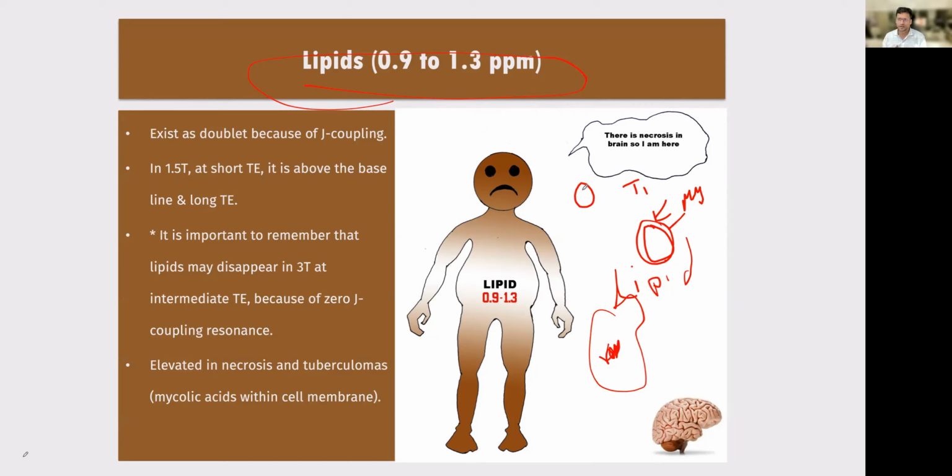I've been lucky to travel with a great neuroradiologist from our country. He has worked on 14,000 gliomas. And I asked him, sir, if I give you all the imaging sequences and ask you to pick up one sequence to diagnose gliomas, what would you pick? He said conventional imaging is the best.